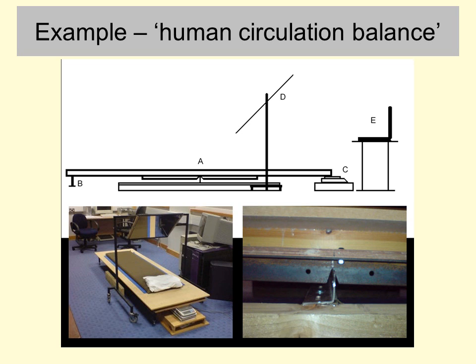And of course what you're directly measuring is the levels of oxygenated hemoglobin relative to deoxygenated hemoglobin, whereas this thing measures a value in newtons or grams, if you like, which is related to actual volume of blood, which is of course a different variable.